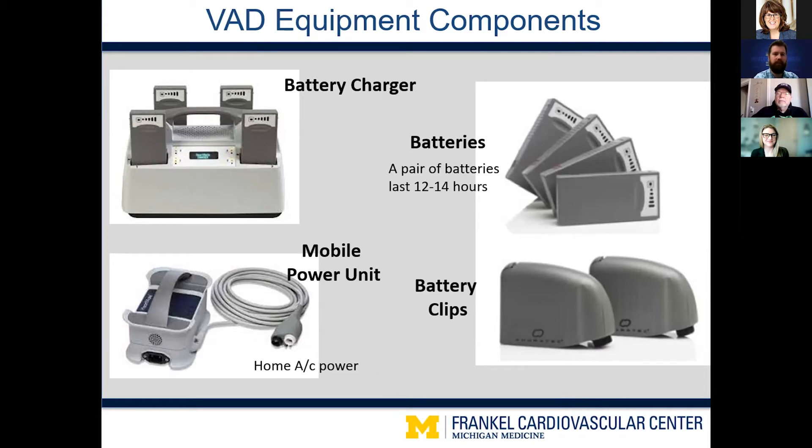On the right side we have what they carry as they're walking around and not connected to the mobile power unit — their batteries and battery clips. A set of fully charged batteries will last about 12 to 14 hours, so in most cases patients can go an entire day without worrying about changing their batteries or their controller beeping because batteries are getting low.